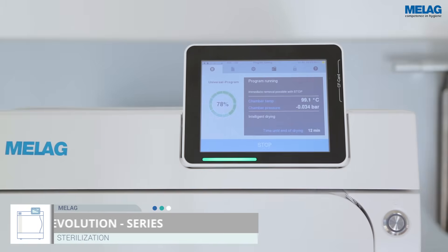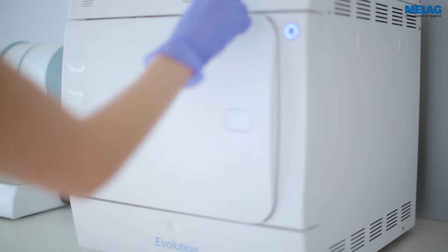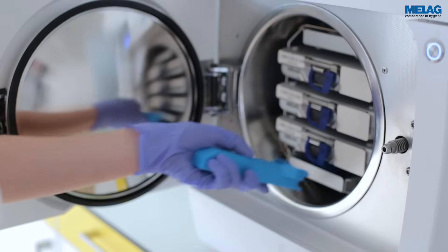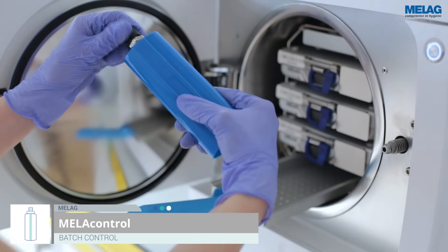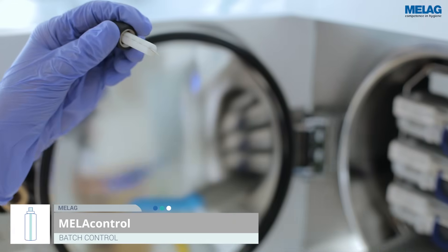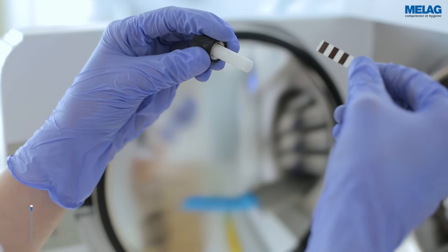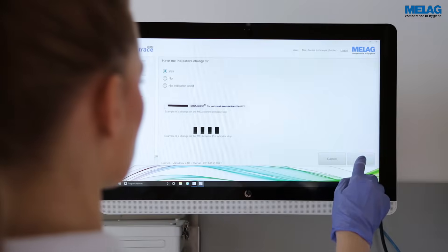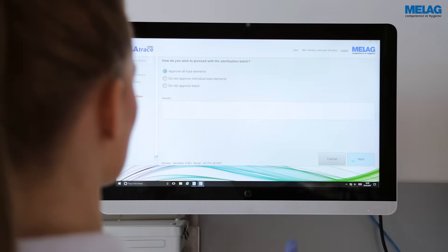A further advantage is our unique DryTelligence, an intelligent drying system which adjusts the drying process to each individual load for optimised results, time saving and resource efficiency. The approval of the sterilisation procedure requires inspection of the MeLaControl and the sterilised load. The entire process is then recorded in a legally compliant decontamination report provided by MeLaTrace.